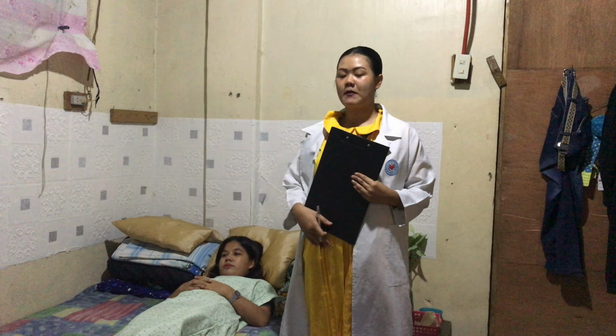Okay. Okay po. So, now we will be proceeding on the gathering of materials. So, in gathering of materials, we have here the materials. This is the alcohol, at least 70% of alcohol. And then we have here a pair of gloves, as I have mentioned earlier. And we have here a pregnancy test kit, as I have also mentioned earlier that it is intact, complete, and the expiration dates are accurate. Then we have also here the specimen container, which will be used later. Okay, so which is clean and clear.